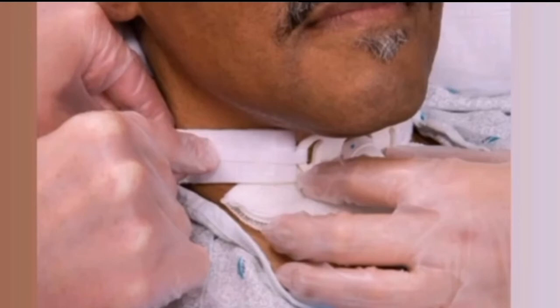The other nurse places the collar around the patient's neck and inserts first one tab, then the other, into the opening of the face plate and secures the Velcro tab on the tracheostomy holder. Check the fit of the tracheostomy collar. You should be able to fit one finger between the neck and the collar. Check to make sure that the patient can flex the neck comfortably. Reapply the oxygen source if necessary.